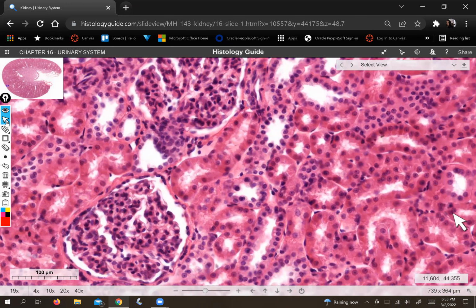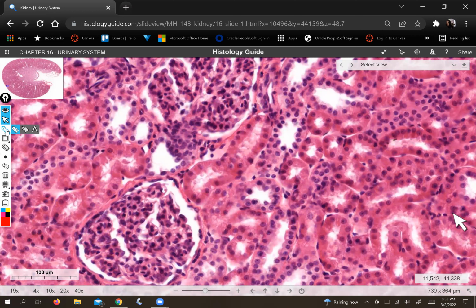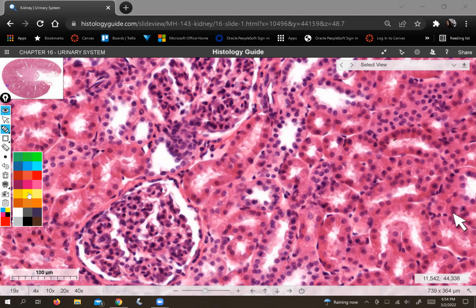Now, fortunately, there's other stuff about these tubes besides the epithelial type that makes it actually not that hard to figure out what you're looking at. You just have to know the tricks of the trade, and that is what I'm here to tell you. So first things first, I do want to point out the very nice macula densa that we're able to see on this particular corpuscle. See these cells here that are very densely packed, and you can tell by their nuclei being densely packed, and then they're more uniformly spaced out in the rest. That's another example of the macula densa.